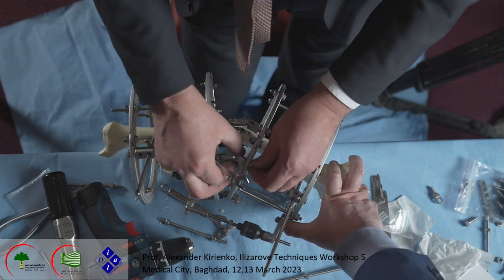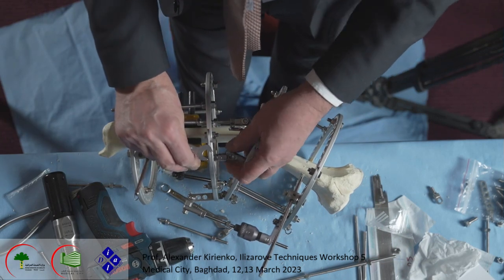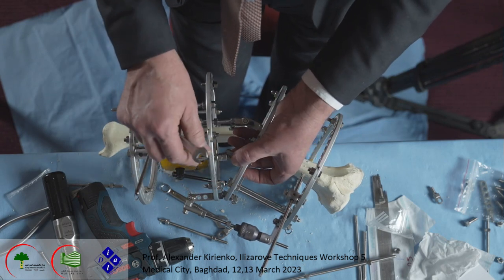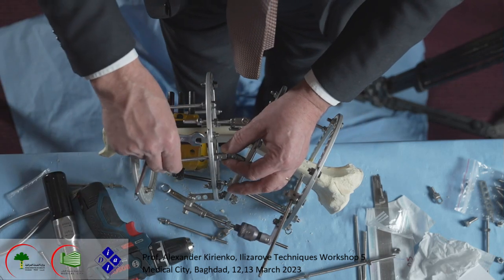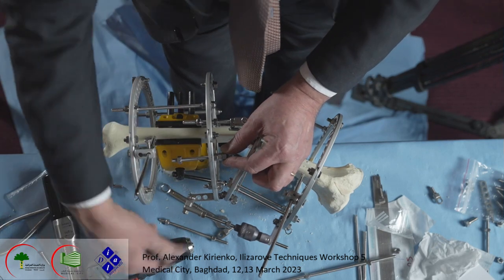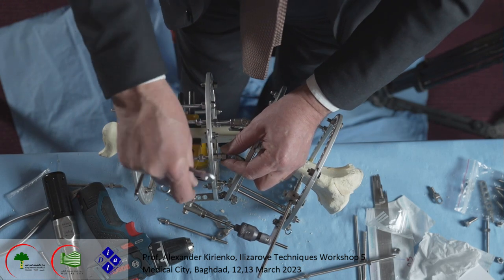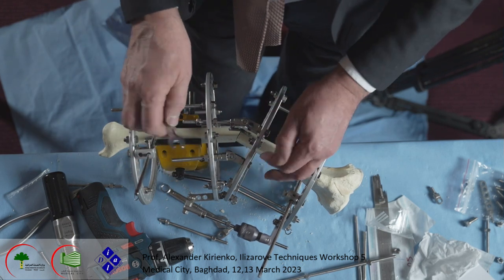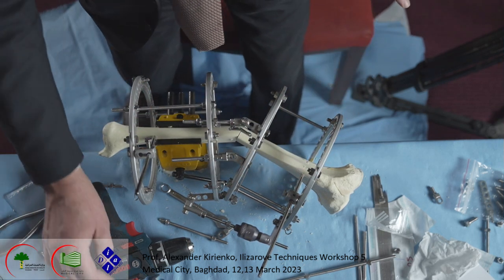Okay. I did this, I attached it, but in any case, you see there's so little space that I can't put it comfortably inside. You see? And this created a little bit of displacement because the rods are not parallel. But this happened because of the big amount of deformity. For this reason, the hinge like this is much more comfortable. But we leave this to show you in any case how it will function later, because the principle of this system remains.